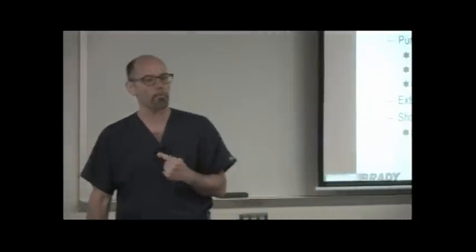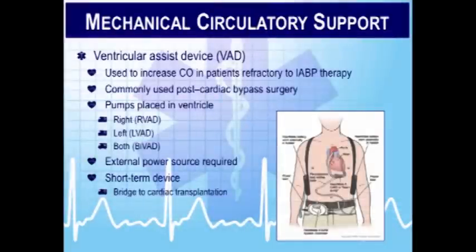Obviously, the patient that has peripheral vascular disease, like a diabetic with a balloon pump in, actually the highest rate of complications like that for balloon pumps are female diabetics with peripheral vascular disease. Small body habitus, small blood vessels that are peripherally damaged, and if you're diabetic, you know you already have bad vasculature. So that is the patient population that has the highest risk.